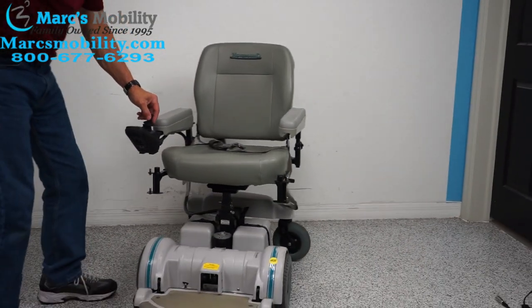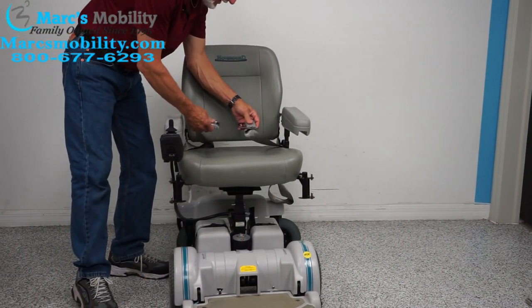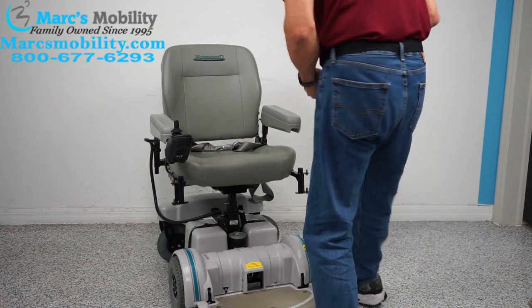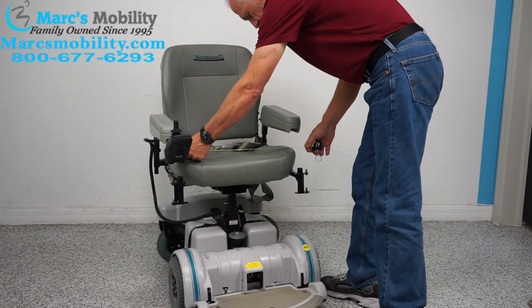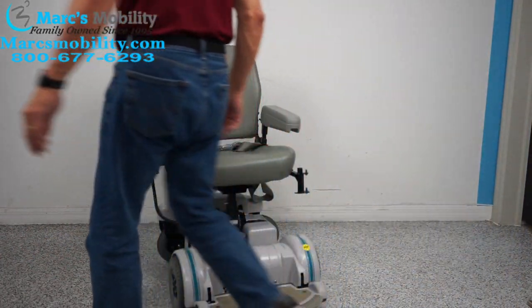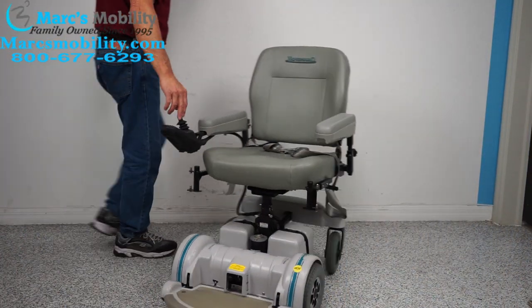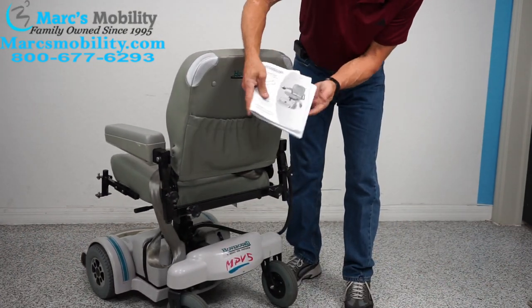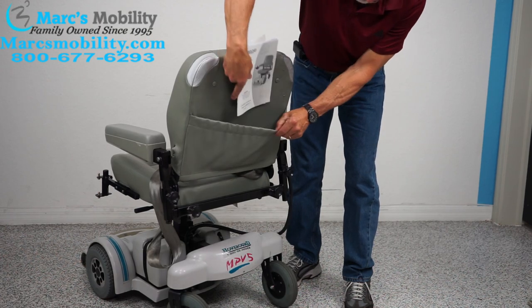You also have a safety belt on here. The seat on this chair is 20 wide by 18 deep. On the back of the chair you have a pouch, and the original owner's manual from the factory from Hoveraround.